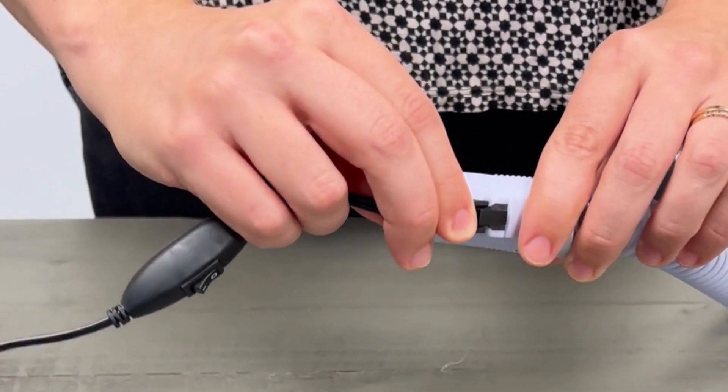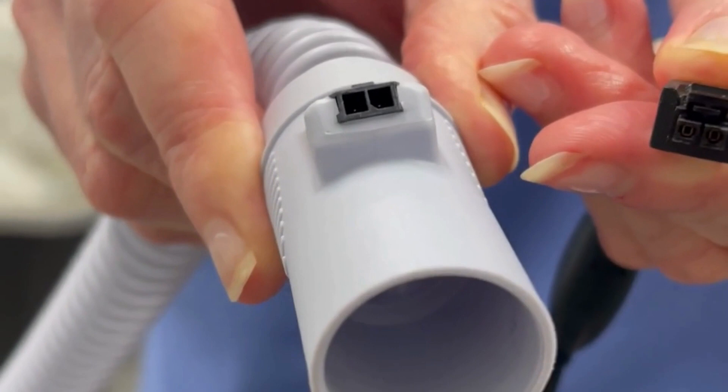The copper wires are embedded in the walls of the tubing so it is safe to wash in soap and water for regular cleaning.